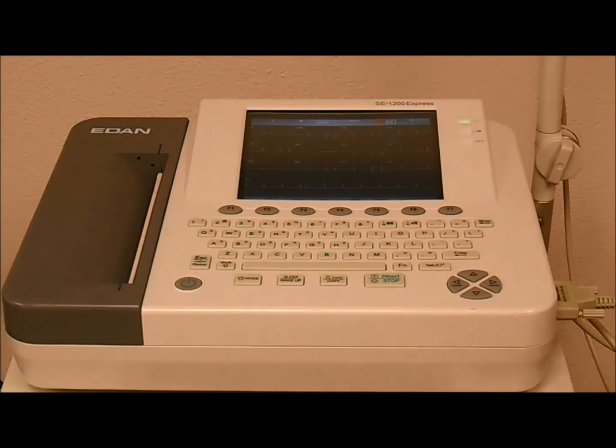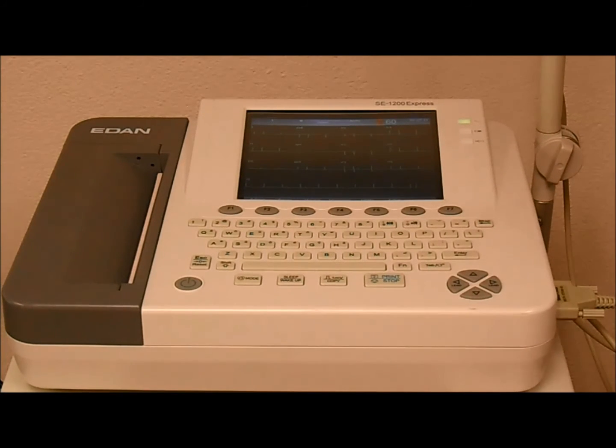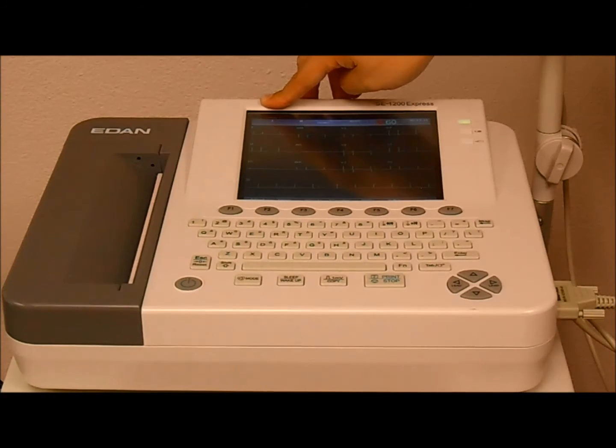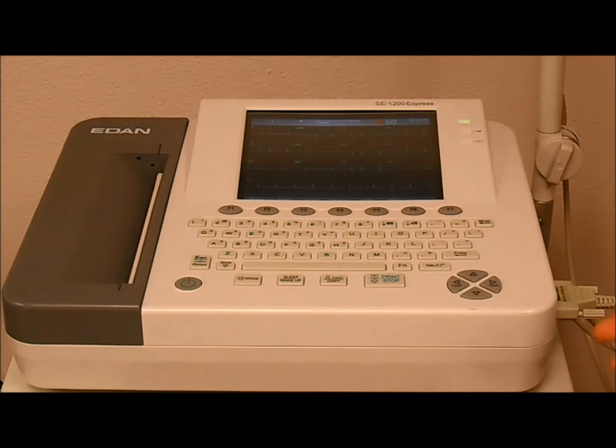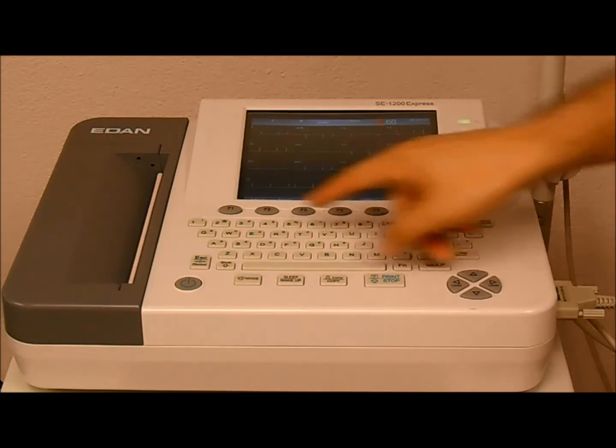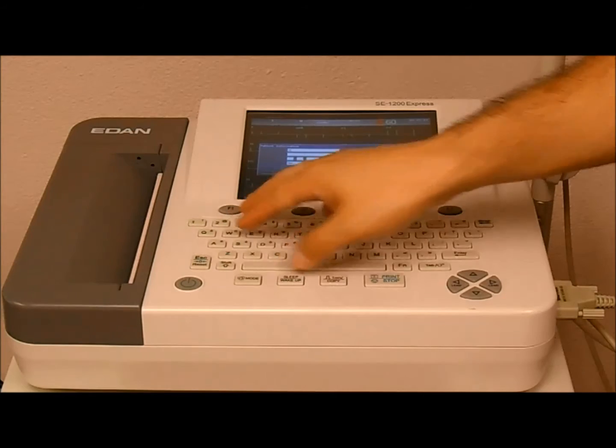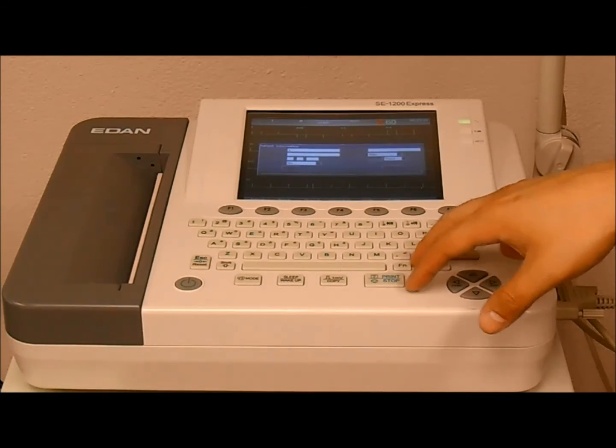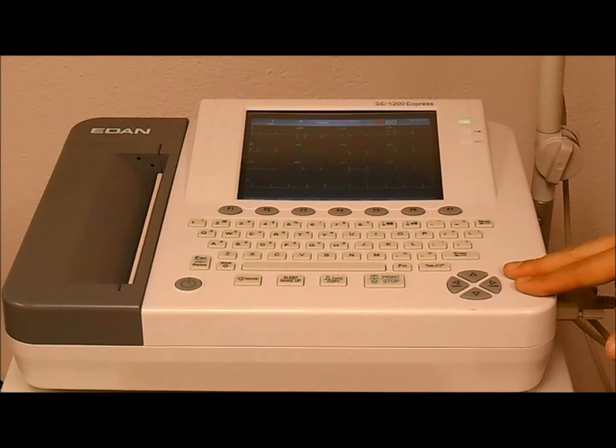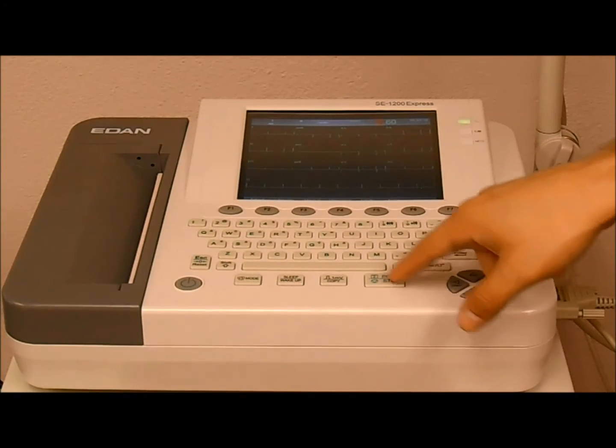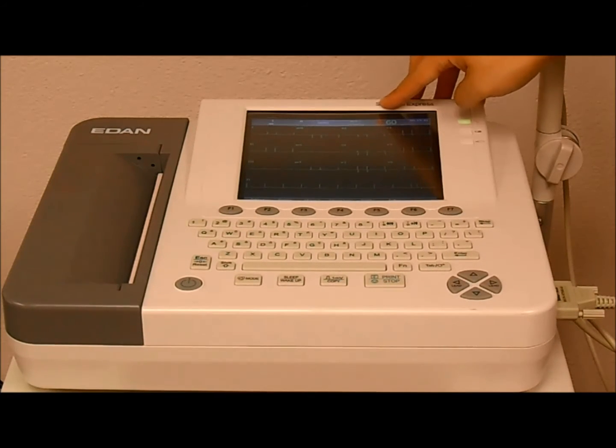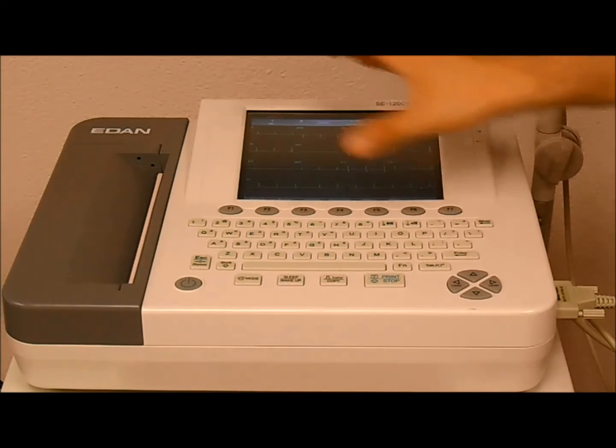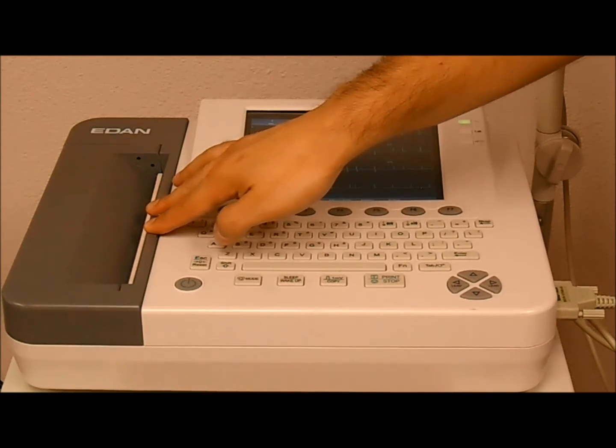Now from a different angle, once we complete the examination for the first patient, after we disconnect the leads, the patient ID will be automatically refreshed. So the patient data of the prior exam is gone. So now we connect the leads to the new patient. We press F1 to enter the information of the patient. And simply all we do is press the print key. The unit starts sampling for 10 seconds, after which it will do the analysis and record the report on the built-in thermal printer.